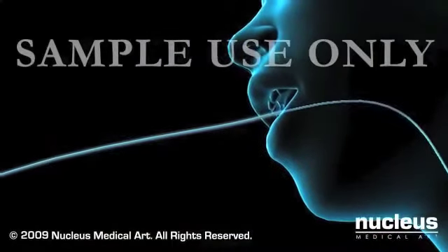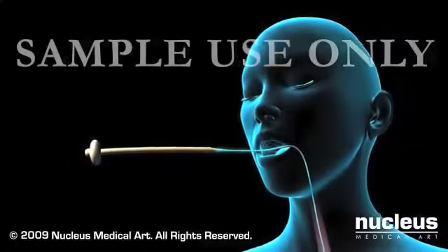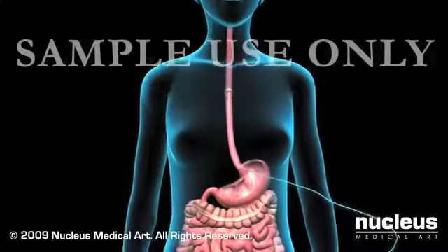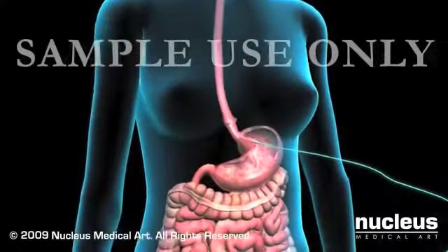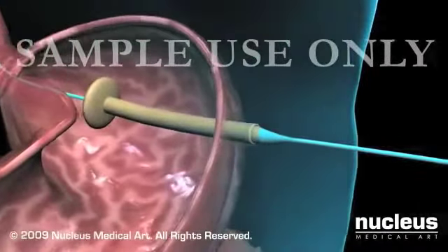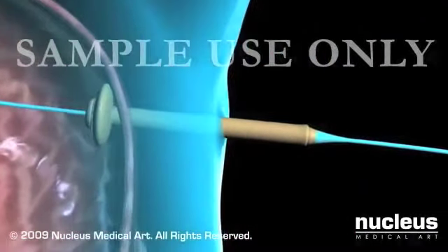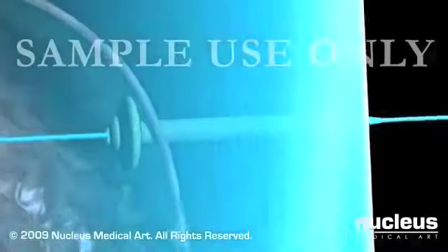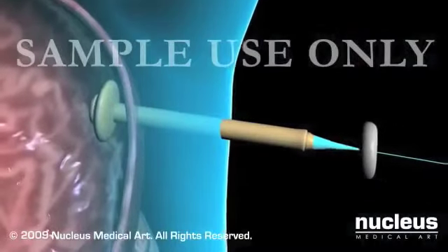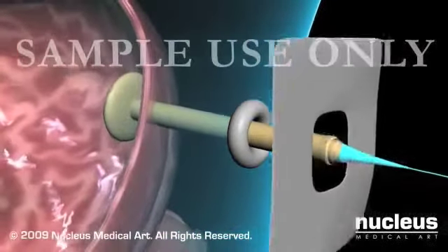Your doctor will attach the PEG feeding tube to the wire outside of your mouth. By gently tugging on the other end of the wire, he or she will pull the tube back through your mouth and esophagus and into your stomach. Your doctor will continue to pull until the tip of the tube comes out of the incisions in your stomach and abdomen. A soft round bumper attached to the portion of the tube that remains inside the stomach secures it in place. The outer portion of the tube will be secured with a bumper as well, and sterile gauze will be placed around the incision site.